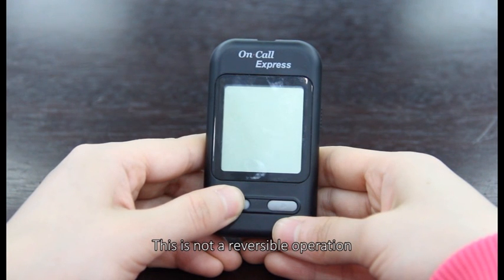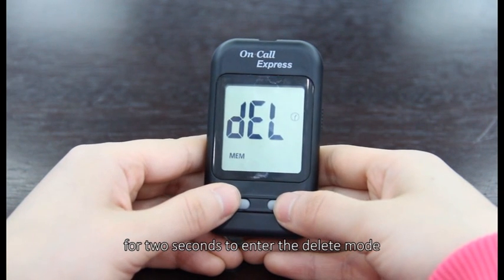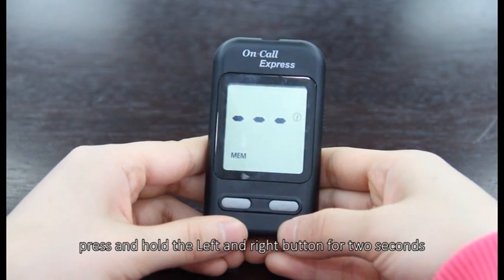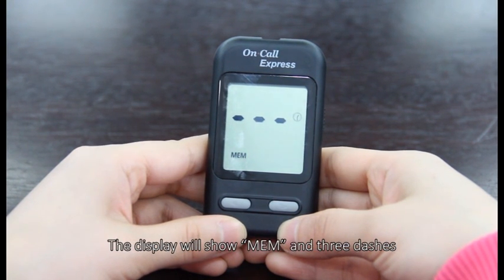This is not a reversible operation. With the meter off, press and hold the left button for 2 seconds to enter the delete mode. To clear the memory, press and hold the left and right buttons for 2 seconds. The display will show memory in 3 dashes.